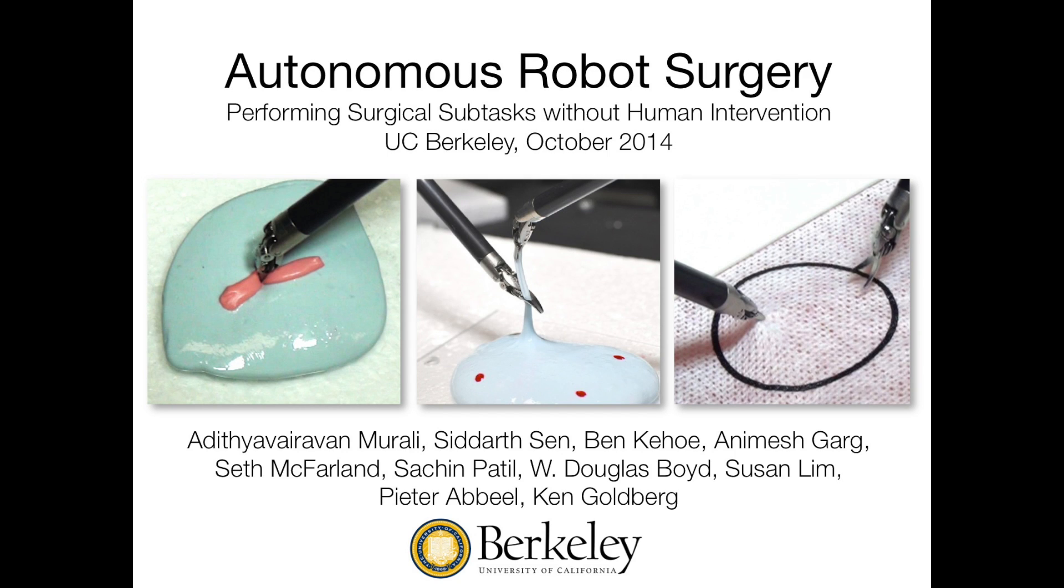We are investigating if a da Vinci surgical robot can autonomously perform tedious subtasks. This video demonstrates new results involving cutting and deformable tissues using a learning by observation approach described in detail in the paper.